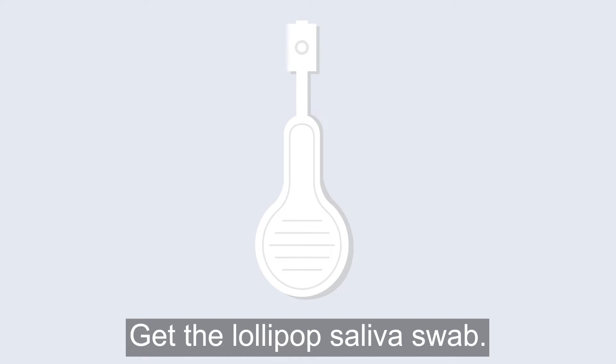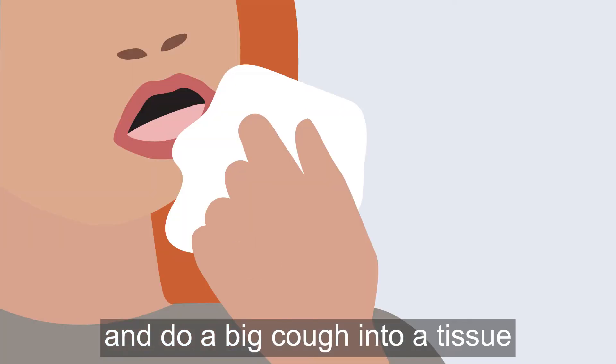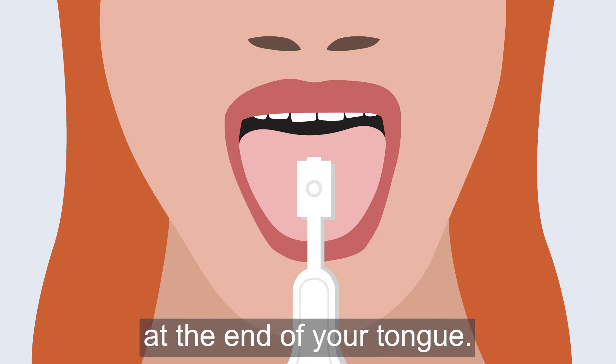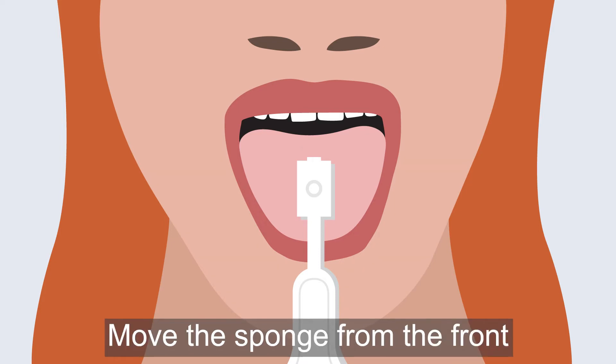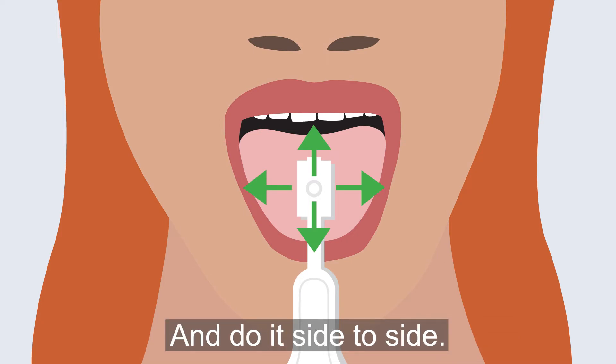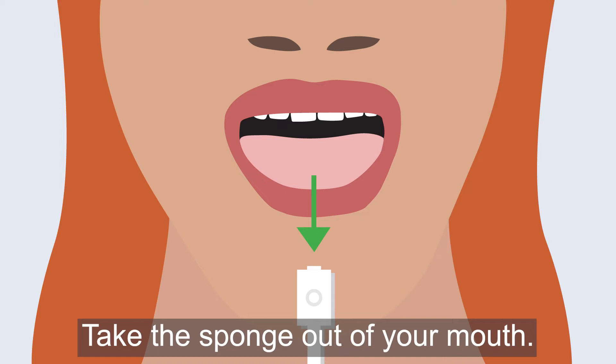Get the lollipop saliva swab. Hold the big round end of the swab and do a big cough into a tissue before you start. Place the sponge at the end of your tongue. Move the sponge from the front to the back of your tongue and do it side to side. Do this for 90 seconds.